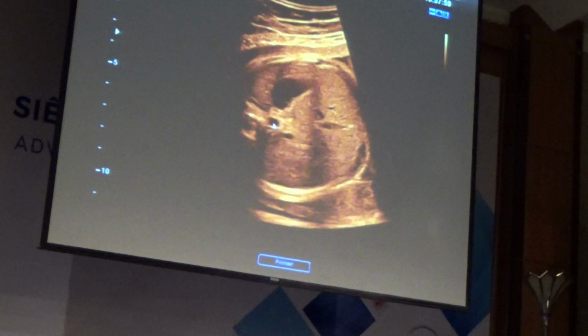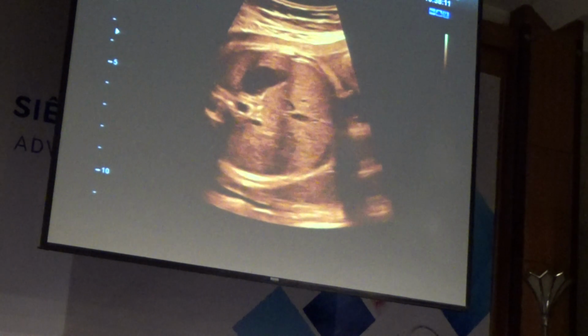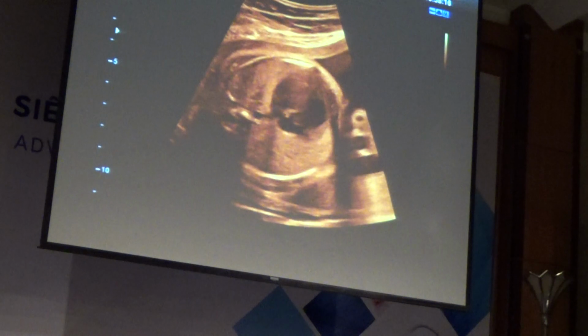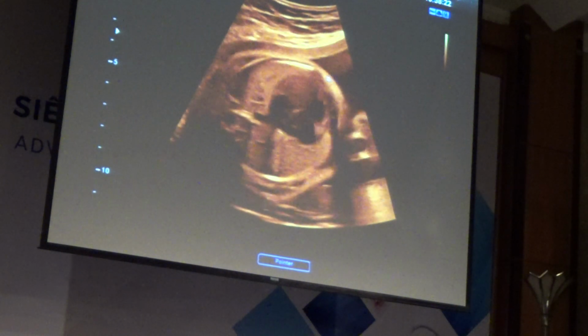So I'm seeing descending aorta and stomach on the left, and IVC anterior and right. And now I'm going to come, and you can just, here's the sweep, showing that the heart's on the left, and the apex is 45 degrees.